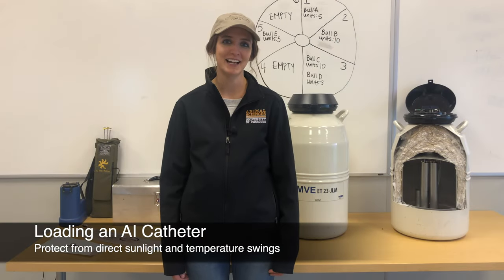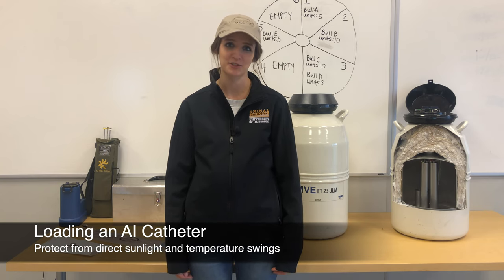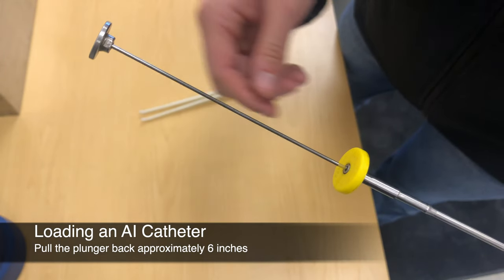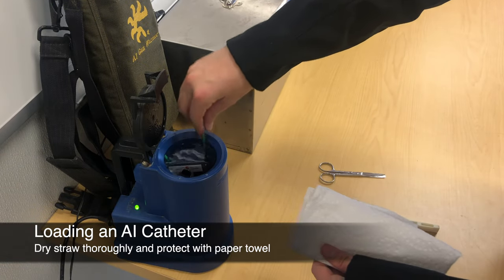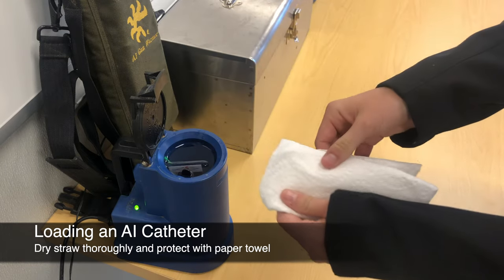When you are ready to load an AI catheter, make sure you are out of direct sunlight in a sheltered area and work quickly to avoid exposing the straw to temperature swings. Pull the plunger back about six inches to allow for insertion of the straw into the AI catheter. Remove the straw from the thaw unit and dry it thoroughly in a doubled-over paper towel, which also serves to protect the straw from ambient temperature or wind.